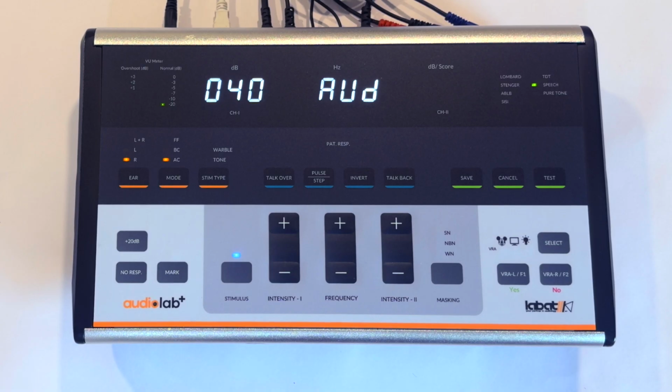As the patient responds, note down the speech score. Repeat this process to note down speech scores for all desired intensity levels. Once completed, press the stimulus key again to turn off the test. To use recorded speech testing, press the Select key again. The Audiolab Plus includes 36 spondee words in English for testing.